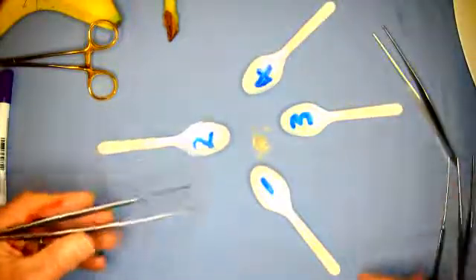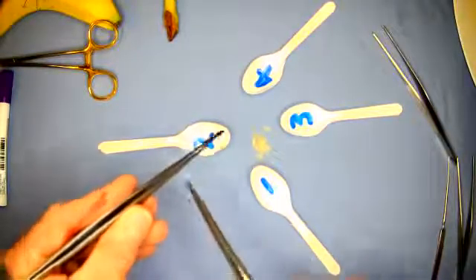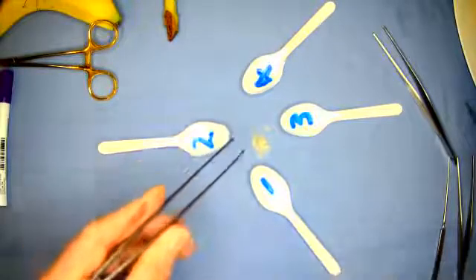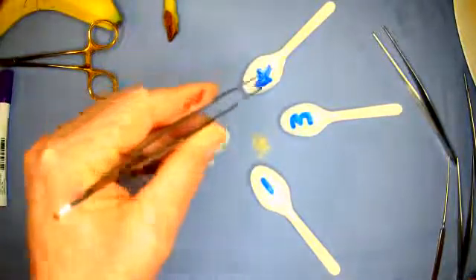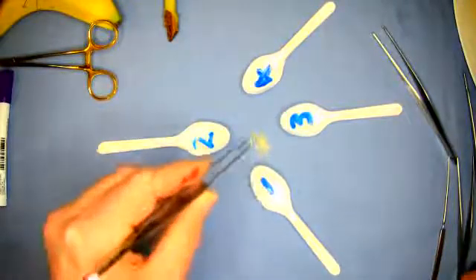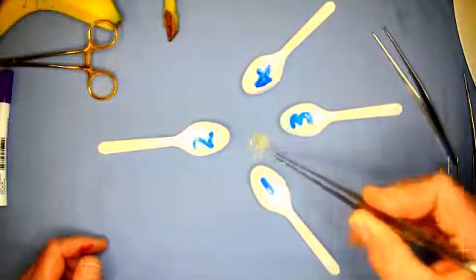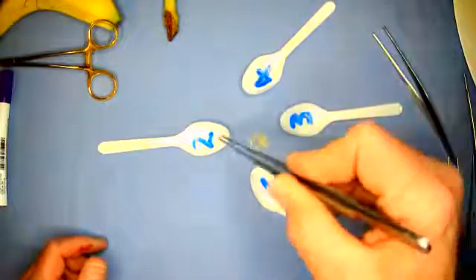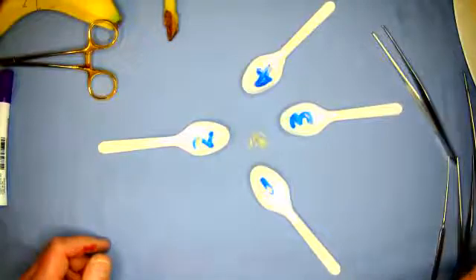Forceps are ubiquitous on all surgical trays, and you need to be able to use them in the right hand and left hand. If you're beginning and you're asked to hold something, you can put another forcep in to pick it up to steady yourself. But what you should be able to do is independently pick up accurately and deliberately with your forceps, both right hand and left hand. And you can make a game of this, and I will put up Harris's video, which is outstanding, where he did this to a metronome, timed it, counted it, and did a fantastic exercise.